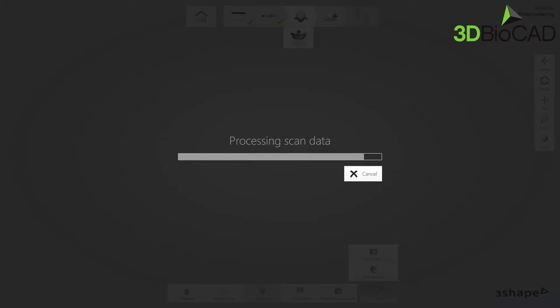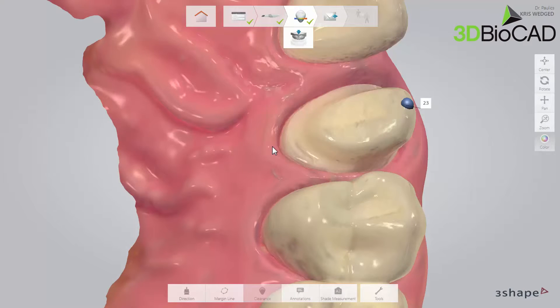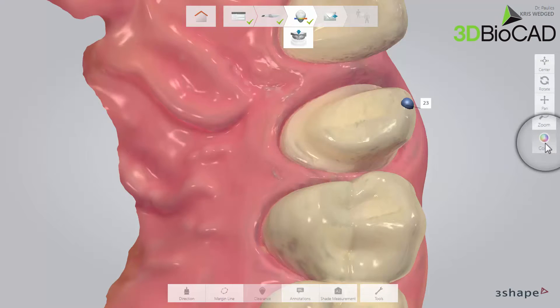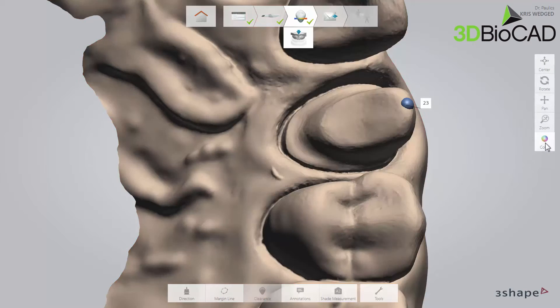If you implement any modification of the scan later on during work, for example adding an HD photo, you will need to do post-processing once again. It is the same procedure that the software always does automatically while sending a case to a laboratory.